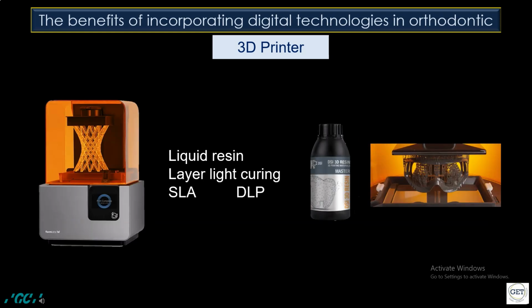Later, a second 3D printing technology was developed, a technology using a light source to cure a light-sensitive resin. The resin is placed in a resin bath and a printing platform is used to cure the object on. The platform is slowly moving up as the material is light cured in layers. There are two different light curing technologies, DLP and SLA.